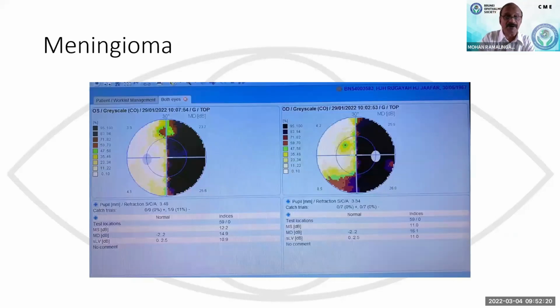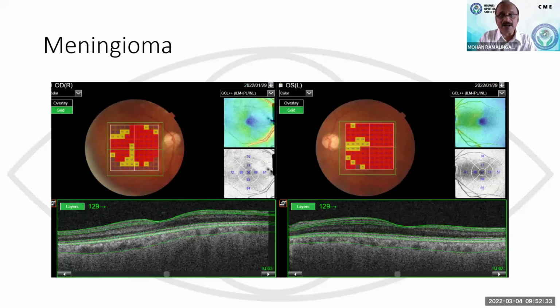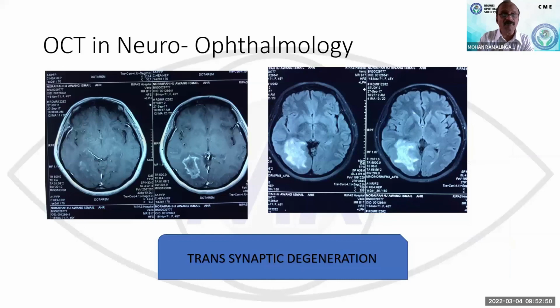So this is one of our patients. He had a meningioma, and you can see the right homonymous hemianopia. So the visual field only shows a right homonymous hemianopia, whereas in the macular ganglion cells, if you see, both quadrants of the macula are affected. So that means that there is something else, or the pressure is more diffuse than to cause a right homonymous hemianopia alone.